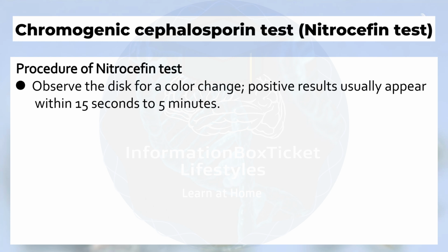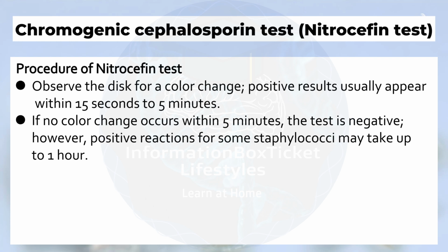Observe the disc for a color change. Positive results usually appear within 15 seconds to 5 minutes. If no color change occurs within 5 minutes, the test is negative. However, positive reactions for some Staphylococci may take up to 1 hour.